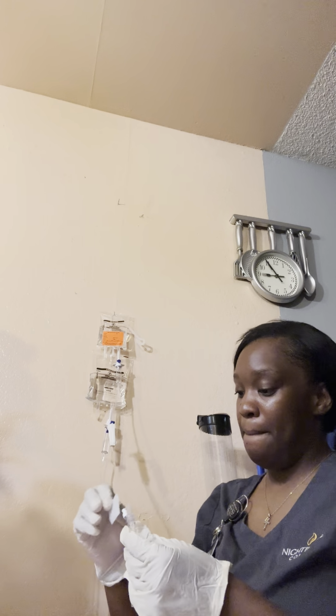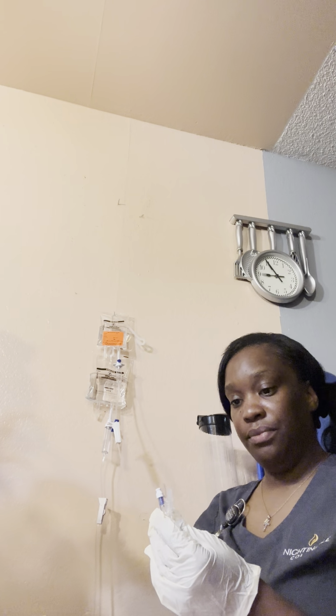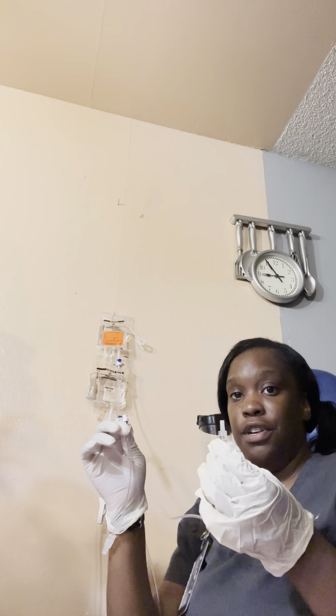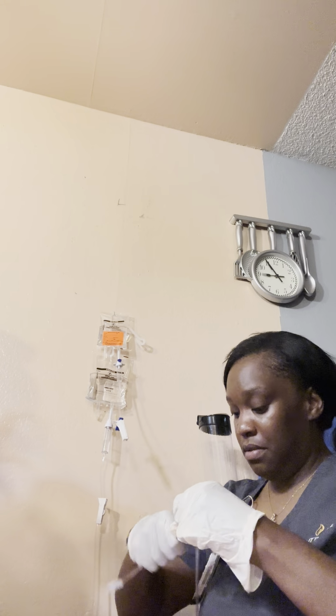Then you're going to connect this to your Y site, but first you're going to want to clean this with the alcohol prep pad. Real good. And you're going to wait about 15 seconds to ensure that it's dry. Okay, then you're going to connect your Y site to your adapter end. You want to make sure it's on there nice and snug. So for the medication, you want to do 100 drops per minute. So again, we're going to slowly release.